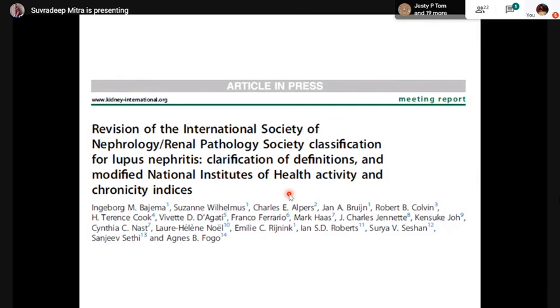But histomorphologically, you see normal morphology, and no mesangial proliferation or endocapillary proliferation is a no-no for this type 1, or minimal mesangial type of lupus nephritis. Of course, the patients are often asymptomatic at this point of time, and this is rarely biopsied.